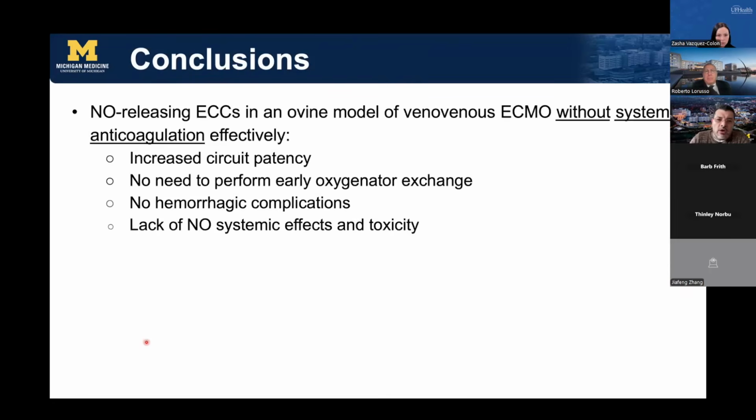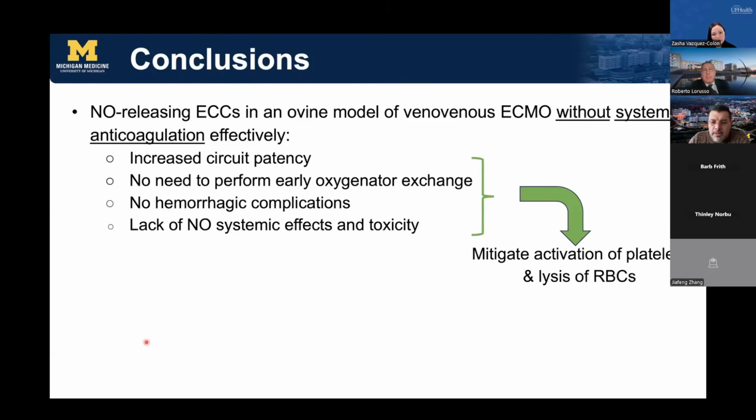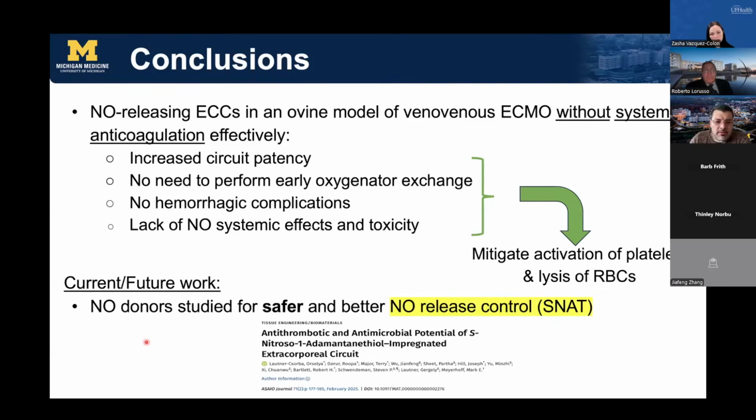In conclusion, NO-releasing systems in an ovine model of VV ECMO without systemic anticoagulation is possible and effective. It increased the circuit patency. There is no need to have any oxygenator exchange at the beginning. We didn't have any hemorrhagic complications. The systemic effects and toxicity of NO need to be studied, but we didn't have any issues with our animals in both groups. I think that all of this is a suggestion that we are, as Dr. Annich and Bartlett proposed, mitigating the activation of platelets and the lysis of red blood cells.